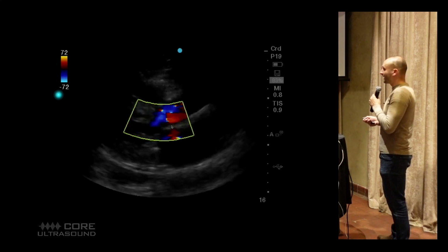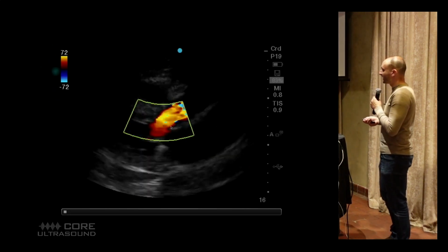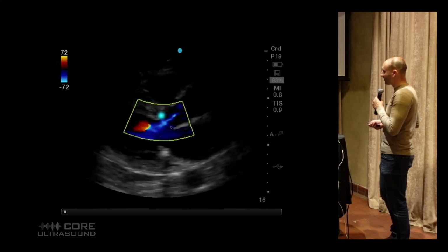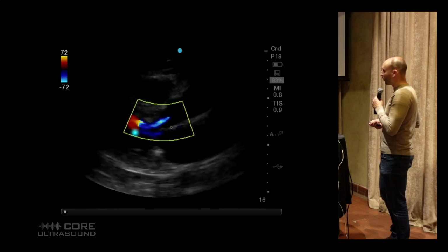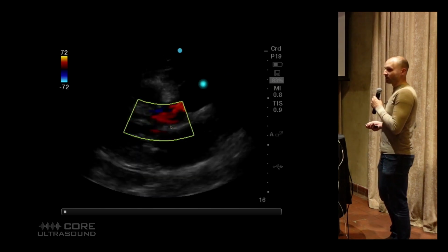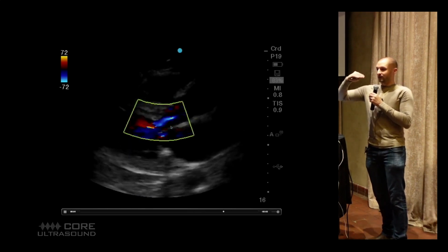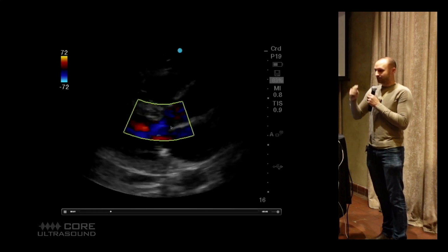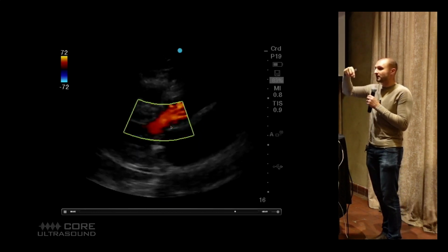So that's usually what I do. I don't remember blue away or red towards. I just look at this and say, okay, this flame right here that looks like it's going this direction, this is a negative deflection, this is going negative away from the transducer. Blood should be moving this way. That means this is a regurgitant jet because it's moving the wrong way for blood, based off of whether it's below that line or above that line. It's not always going to be perfect down and perfect up. The best signal that you get will be perfect down and perfect up.